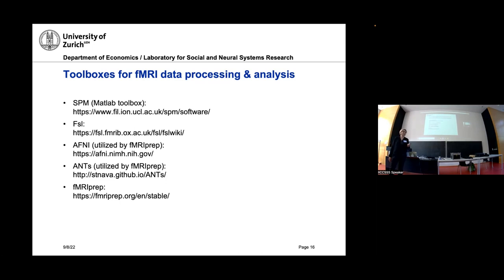So it's very likely if you start with fMRI data today that your PI will ask you about this if you can't use that. It's all based on a data format that is called BIDS, but that's a detail you should have heard about. There's a standard format for fMRI data, and this is based on that.